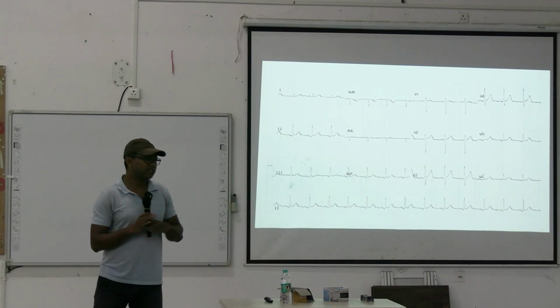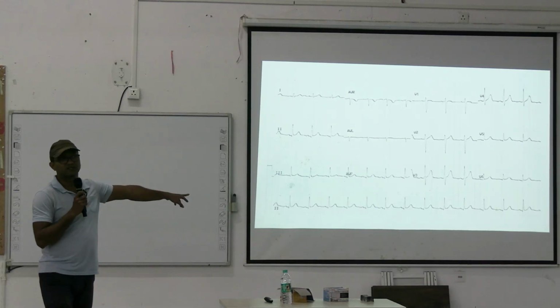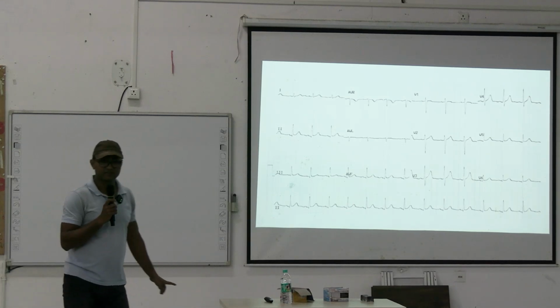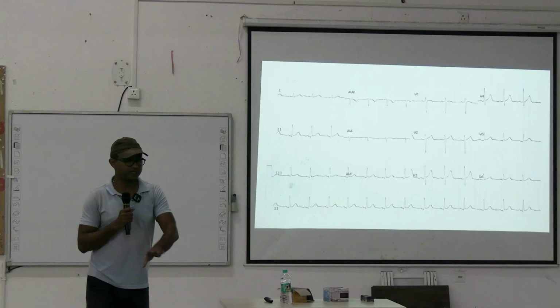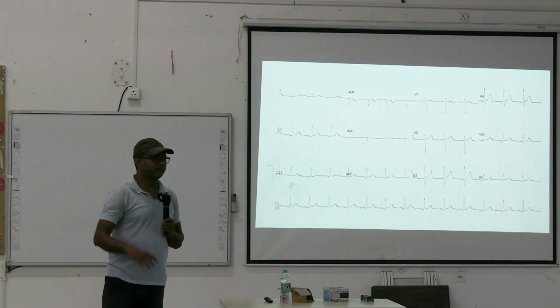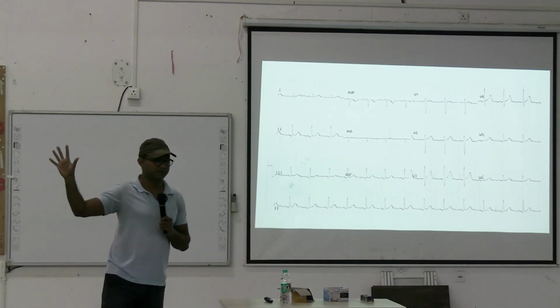First is just by seeing an ECG whether the axis is normal or right axis or left axis. This can be done. And second, you need to take pen and paper, protractor, and draw and tell the exact axis, whether it is minus 30 degree or plus 90 degree or plus 65 degree or plus 70 degree or whatever.